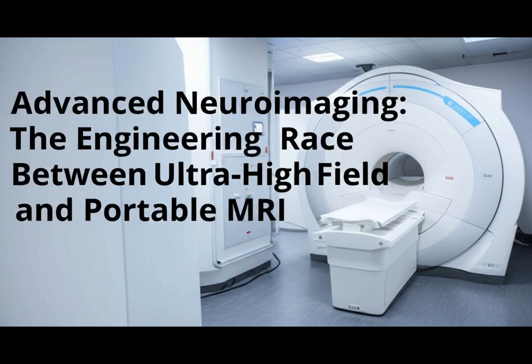This is crucial for research into diseases like Alzheimer's and Parkinson's, and for detecting small lesions in epilepsy or multiple sclerosis. Building these UHF scanners is an engineering feat, requiring huge superconducting magnets with complex cooling, advanced hardware, and specialized radiofrequency coils. But it's not without challenges. Higher fields mean technical hurdles like uneven image contrast and ensuring patient safety regarding absorbed energy. Plus, the immense cost, size, and infrastructure needed mean UHF MRI is mostly found in specialized research centers.